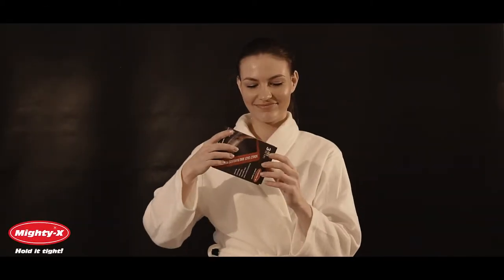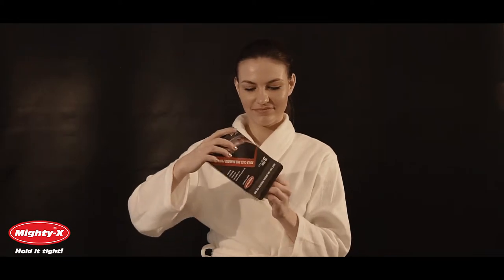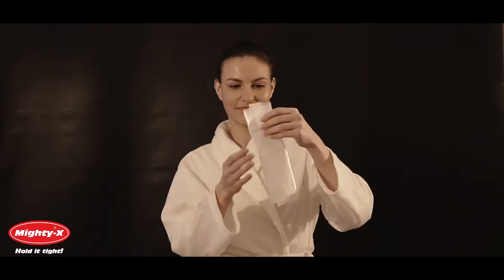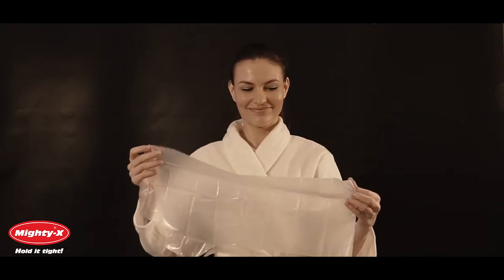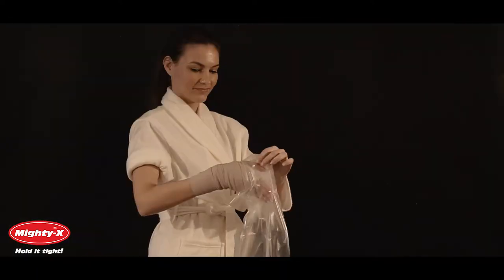Mighty X Arm Cast Covers are created for people who want to shower comfortably in spite of arm injuries. We offer our covers in sets of three, but each cover can be used multiple times if handled carefully. They are made from a durable, elastic and waterproof material which will keep your cast or bandage dry. They provide safe and comfortable showering during the recovery period. Mighty X Cast Covers are designed to fit adult arms and are not suitable for children.